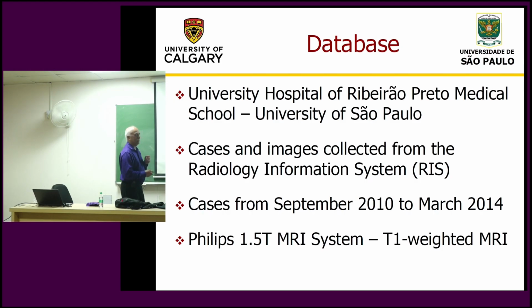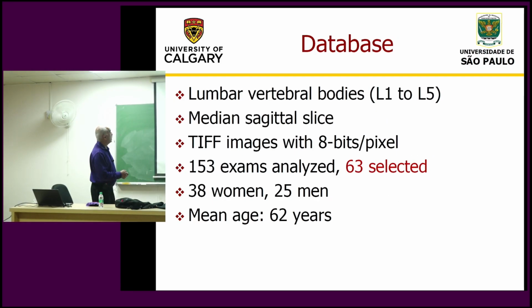Lucas came to my lab in 2015, my last year of work there. Philips 1.5 Tesla and T1 weighted. So we concentrated only on L1 to L5. The protocol was set up by Dr. Marcello. The median sagittal slice was taken.